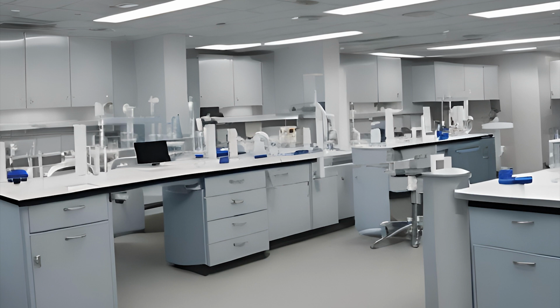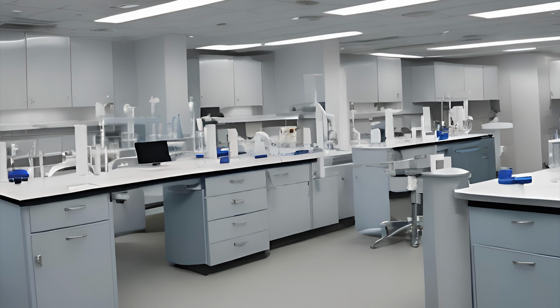The blood cell metabolism is going to continue in your specimen after you collect it. Those cells are still going to be alive for a set period of time. It's going to depend on the temperature of the room you're in, the humidity, various factors like that. But they could be metabolizing analytes and altering the composition of the blood you're about to test, potentially for several hours after you draw that specimen out of the body.